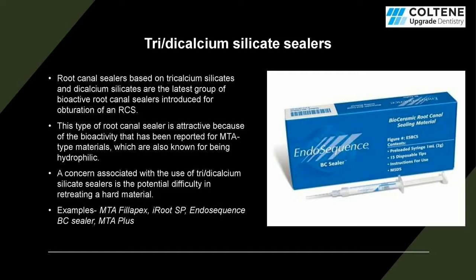Many of us who have used MTA, I think all of us have used it at one point of time, will attest to it that perforation repair with this material gives significant results, but its manipulation and the setting time that it takes makes the job a little bit harder than it should be. Examples of it would be MTA Fillapex and EndoSequence BC Sealer. These are available in the market.